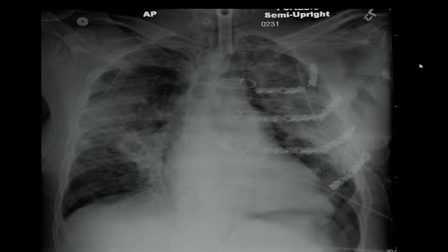What is the most worrisome finding on this radiograph? Of course the patient must have multiple contusions, chest tubes, and you even see something that could be a pneumatocele, that could be a pulmonary laceration. So you see all this going on, but they already know because it's been in surgery, out of surgery, large hematoma. Is there something more worrisome than that?